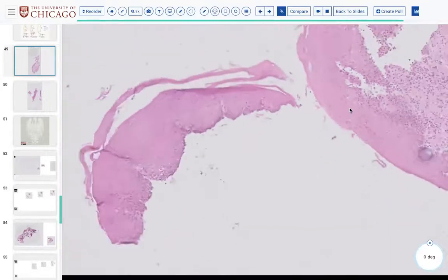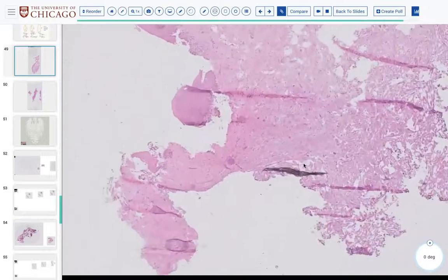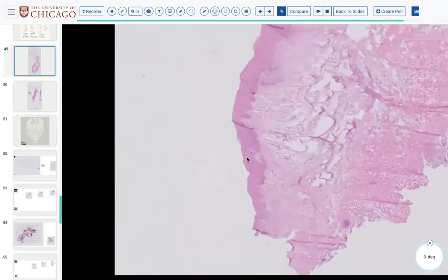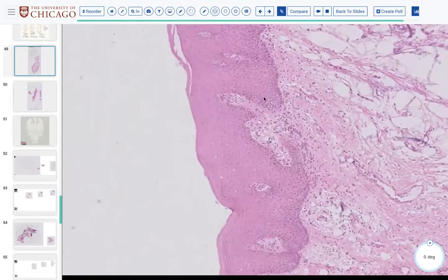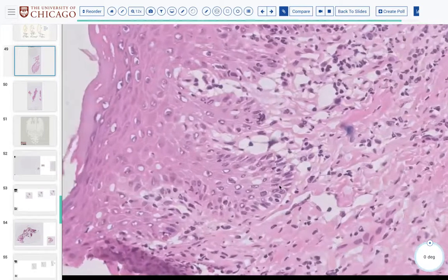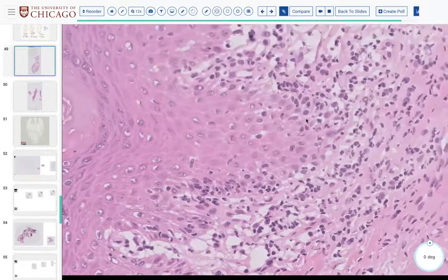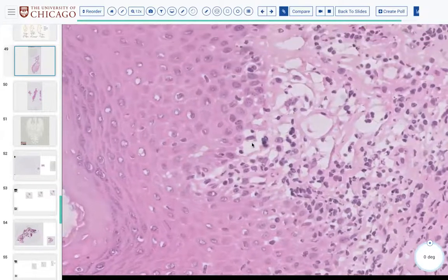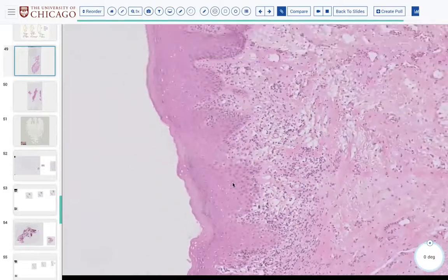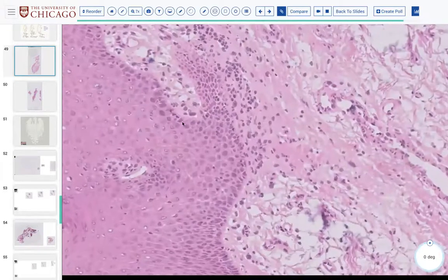So at that point, you're probably mostly in the free and clear, because they're not going to do anything without invasive or in situ carcinoma. I've been called a number of times on these types of specimens where there's some basal atypia, some nuclear orientation disorganization, and they ask me what to do. What would you guys do in this case, for example?